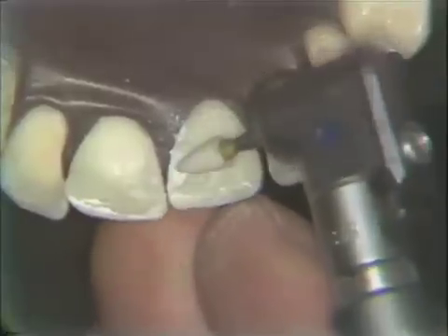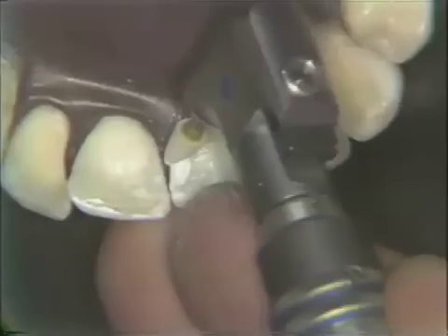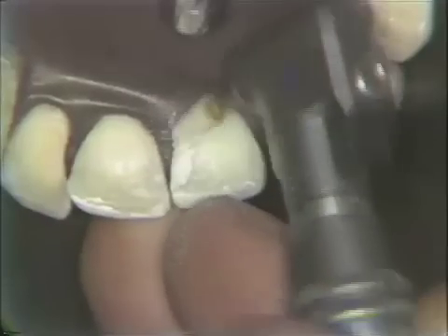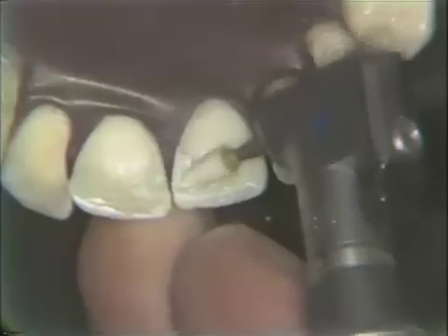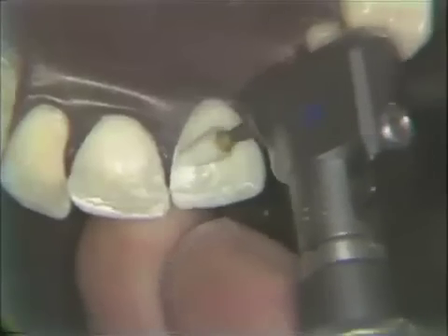The carrot-shaped stone is brought into play. This can also, depending on the contour of the tooth, or how you use these stones, be used mainly for the contouring of that outer incline of the marginal ridge. Now look closely at the cervical. You'll see we still have a little excess.